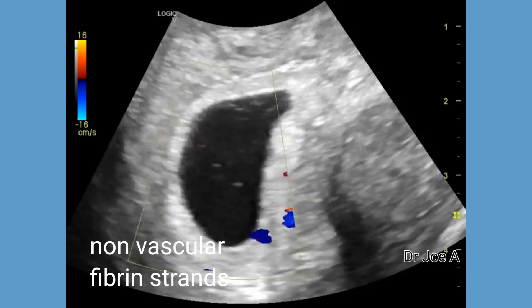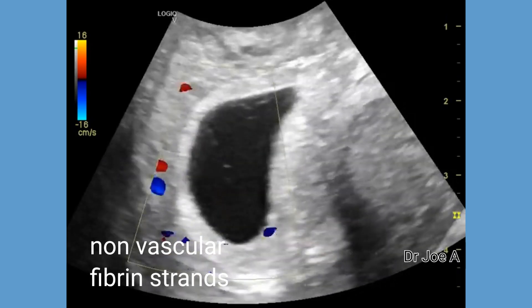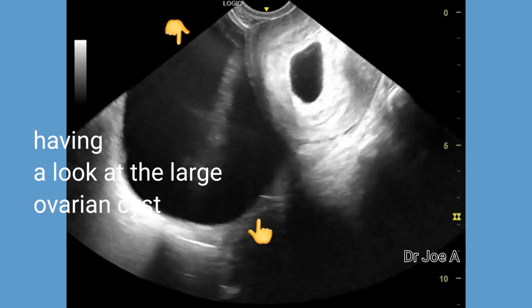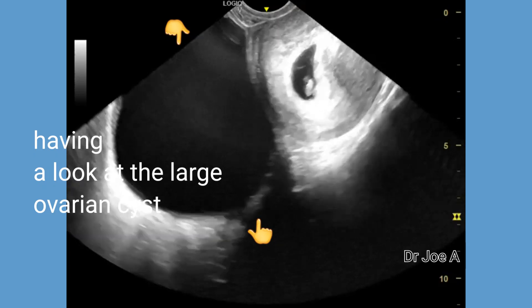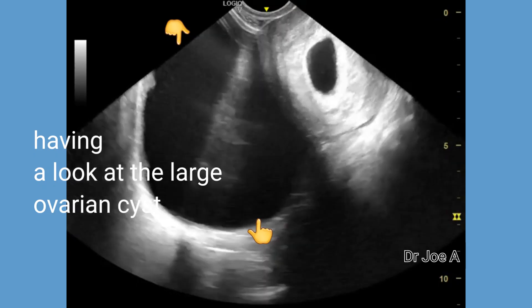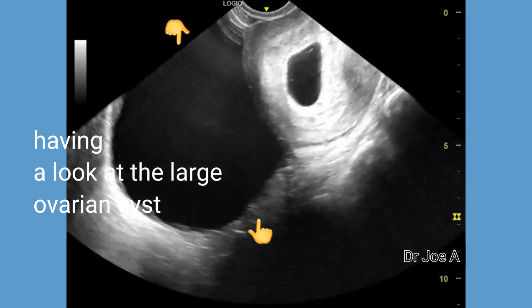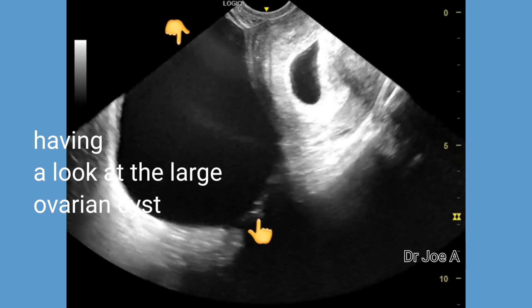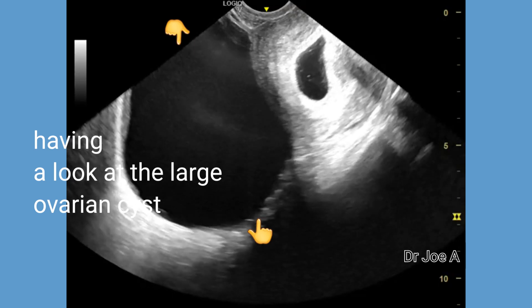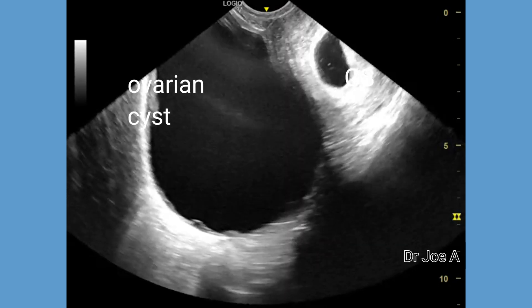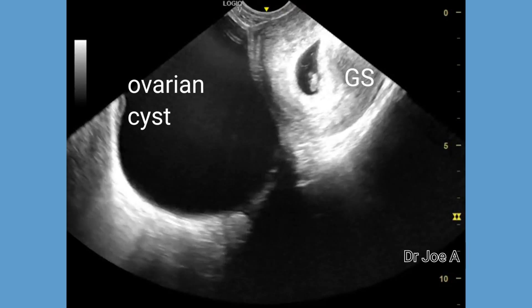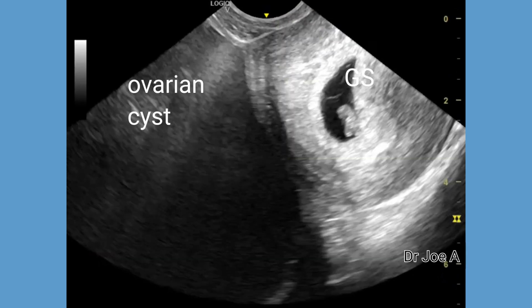Some of the other causes of such an appearance within the gestational sac include subchorionic hemorrhage, which can also produce small strand-like material within the gestational sac. In some cases, the residual lining of the uterus may lead to the formation of fibrin strands within the gestational sac. Sometimes a miscarriage can begin but not complete, also leading to the formation of fibrin strands. Other signs of an incomplete miscarriage may include bleeding and cramping.